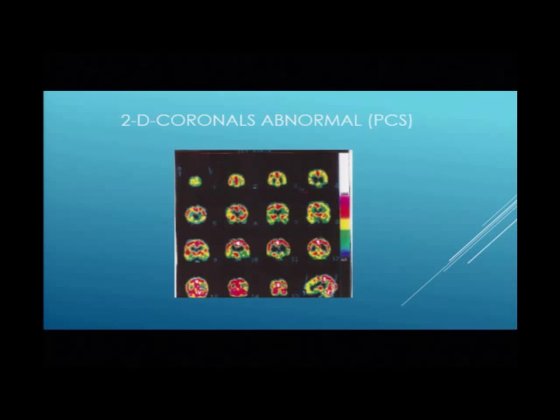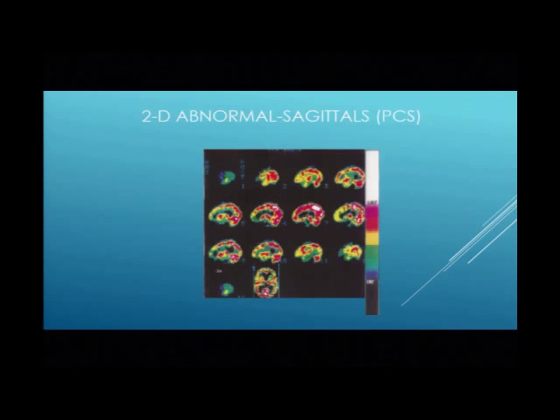So I'm going to show you the next slide, which makes it easy to see the difference of perfusion from front to back. So again, here's the front on all of them, and here's the back. And there's a pretty big difference between the yellow and the green and the interrupted. See, here's the bottom, right? And there's the right side, there's the left side. And if you follow this ribbon back, it gets thicker, it gets more regular, and it gets the brighter colors. And that is the gradient that I was telling you before from front to back. Very easy to see. A difference of perfusion of probably 50 or 60%.